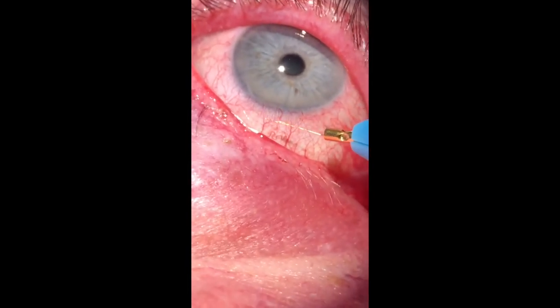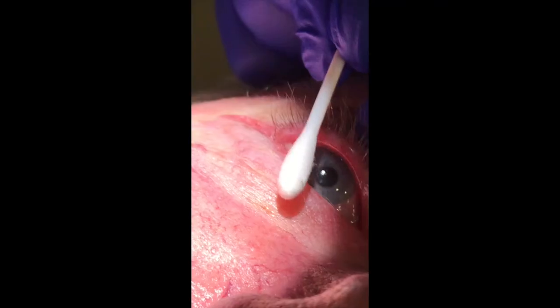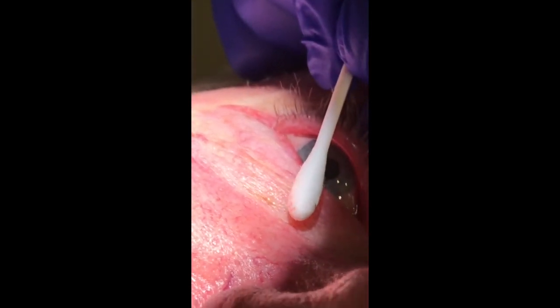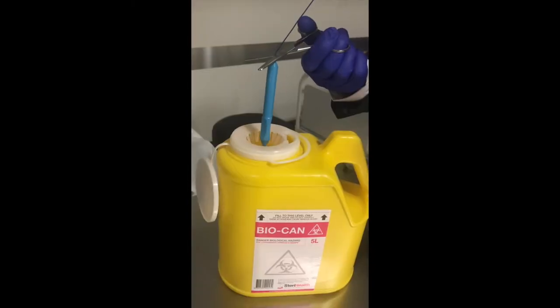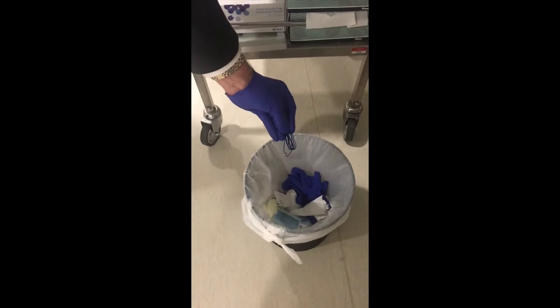The hair can also be wiped out of the follicle with a sterile cotton bud. If either of these is not possible, try lifting the hair out with forceps, but if any resistance at all is felt then the hair follicle needs to be treated for longer, as ablation has not been achieved.